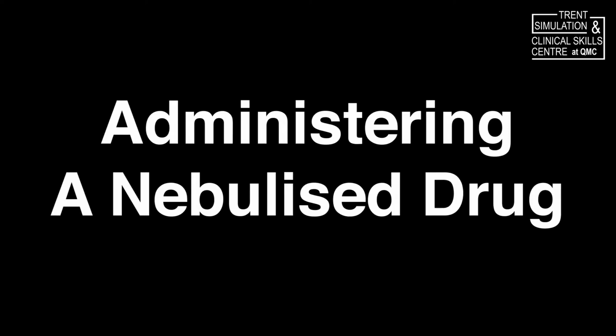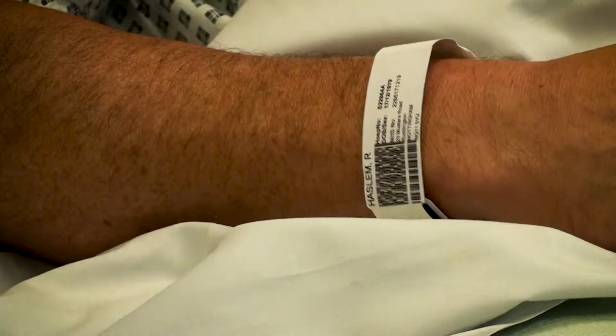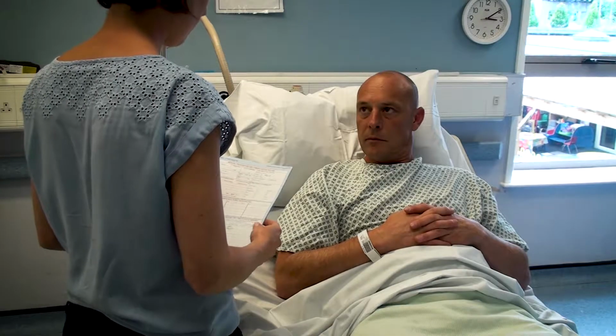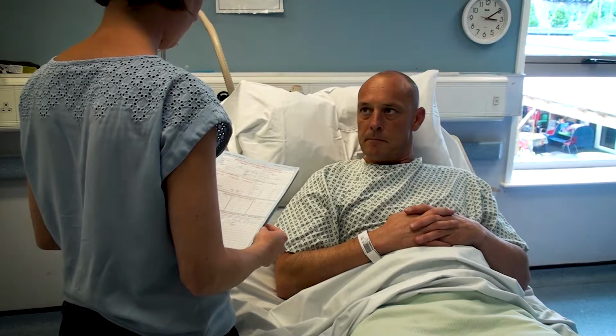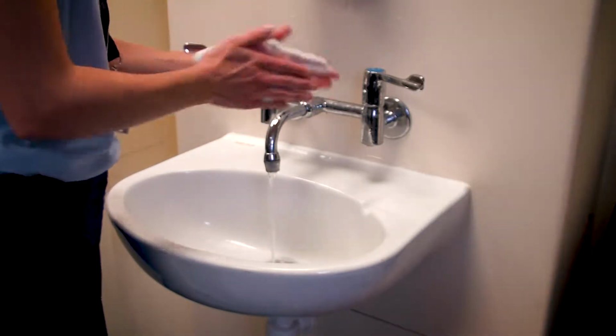Welcome to the clinical skills video for administering a nebulized drug. Prior to performing this procedure on a patient, you must ensure that you have obtained verbal consent and explain to the patient about the procedure you're about to perform. You must also inquire about any history of adverse reactions or allergies to the drugs that you may be about to administer. You must then wash your hands thoroughly using the 11-stage approach.